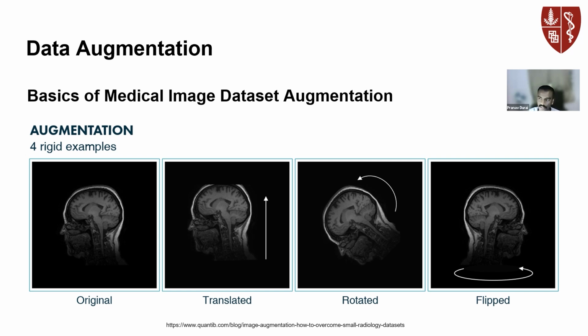So this is the original image, and you can see that you perform some kind of translation over here, right? You include some kind of padding as well. And you can also do rotations, right? Based on some angle theta. And you can also flip these images vertically or horizontally to increase some kind of variation in your data set, which means you can naturally increase the number of samples for each image, right?